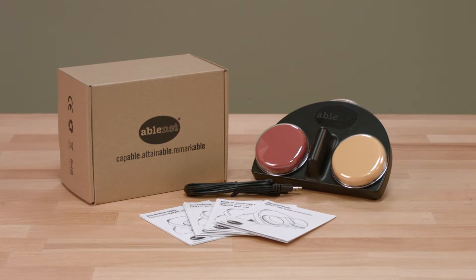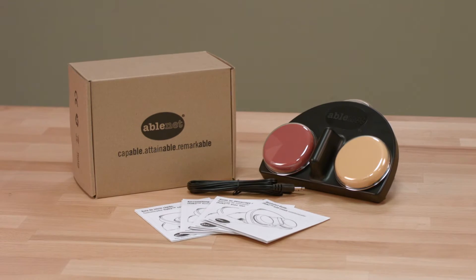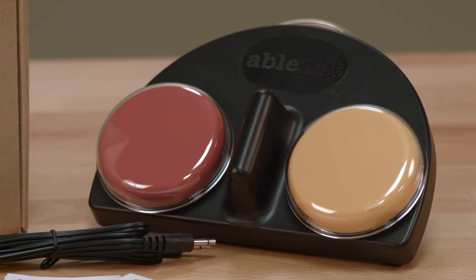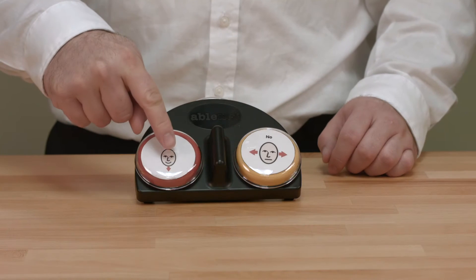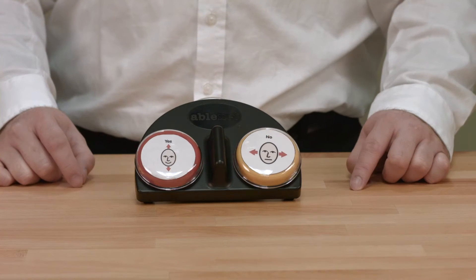Hello, today we're going to talk about the iTalk 2 with Levels dedicated speech generating device for augmentative and alternative communication. The iTalk 2 with Levels provides the user with two separate messages to choose from. This is perfect for any choice-making activities such as answering yes or no questions.